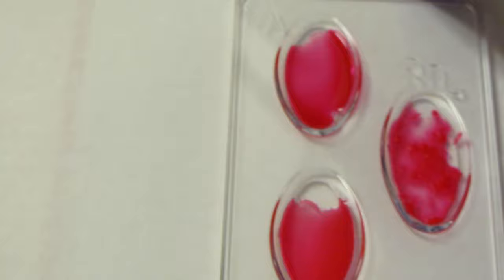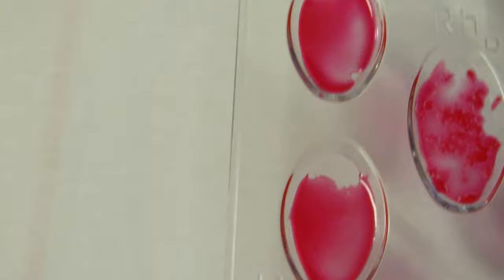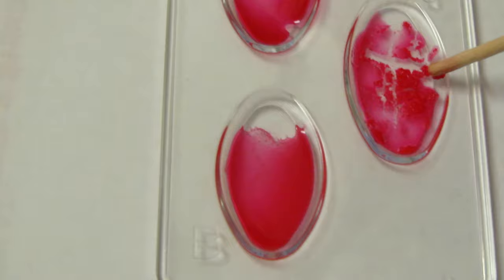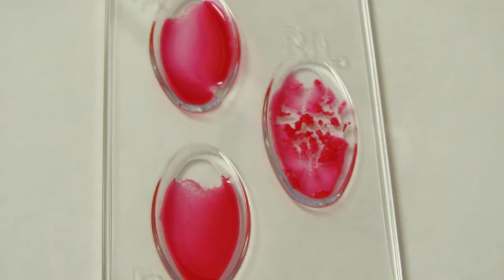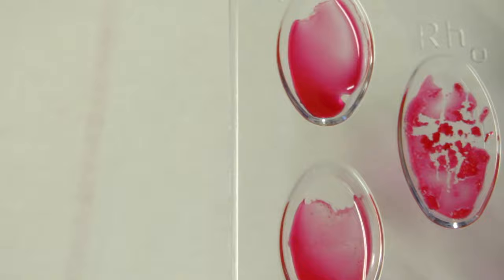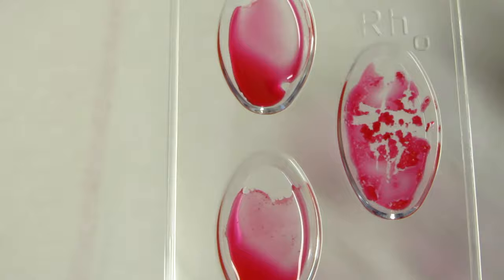Two more samples to go. This one is all nice and clear in both the A and B wells — look how runny that is, there's no clumping at all. But compare that to the RH: look at that, there's so much clumping it just turned to jelly. Since there's no A and no B, there are zero antigens present — remember, type zero is what we call type O blood. So this would be O positive because we definitely have clumping in the RH.